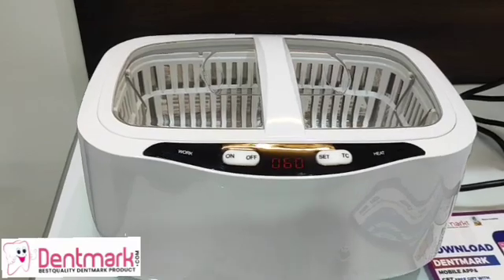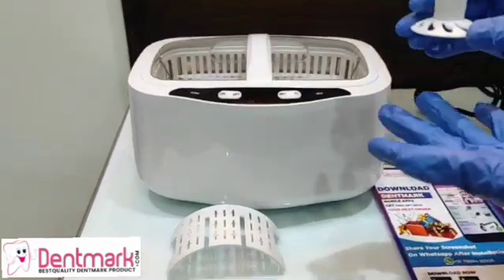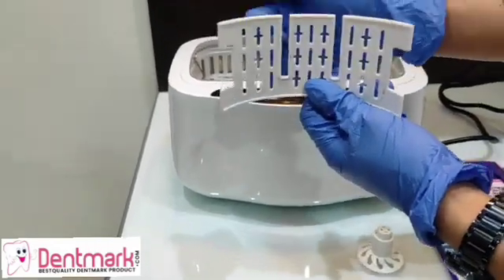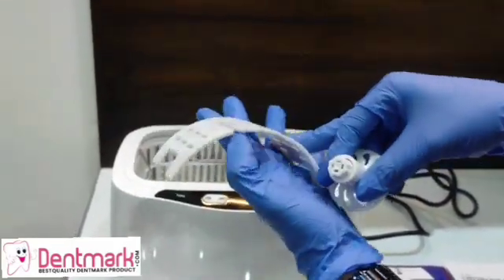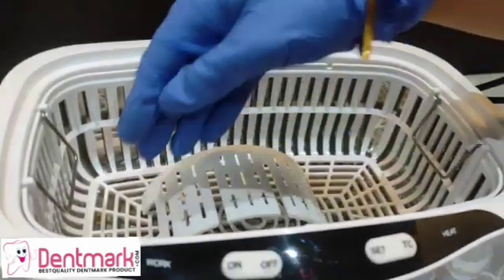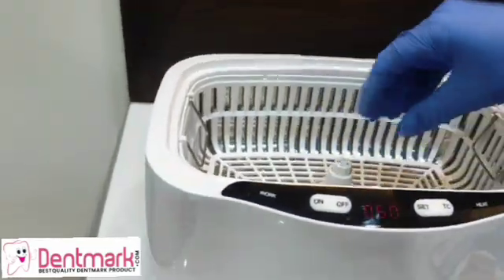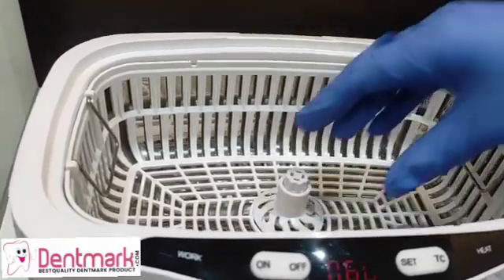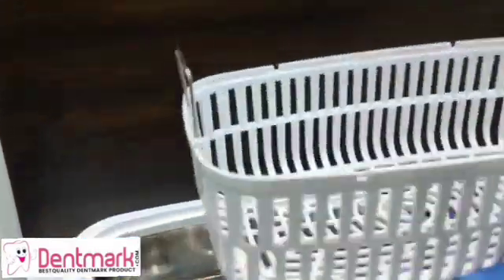This 2,500 milliliter — or 2.5 liter — ultrasonic cleaner has different parts. This is the watch bracket, and this is the disc bracket, which is used to keep various instruments or dental tools. The watch bracket is used to insert a watch, and the disc bracket is for keeping other instruments inside the cleaner.